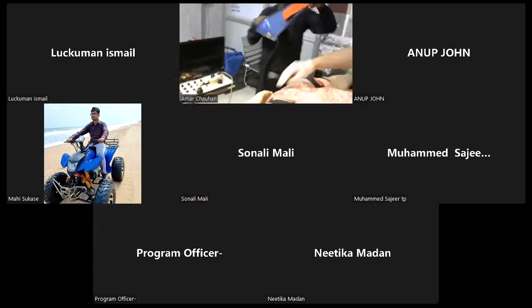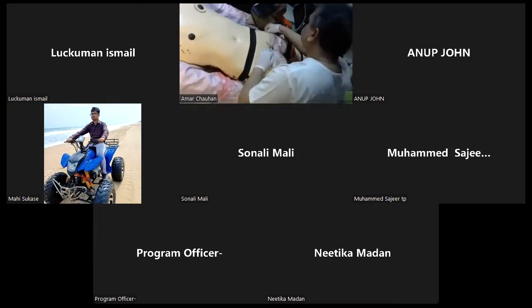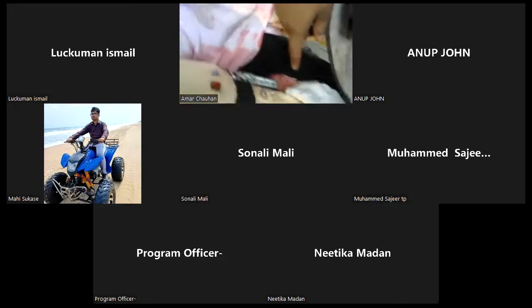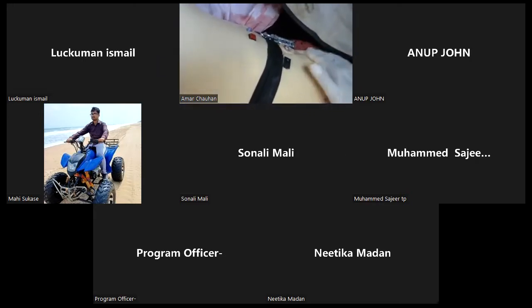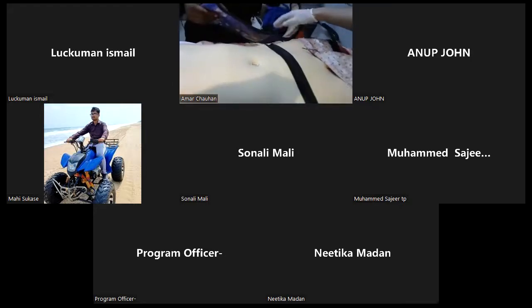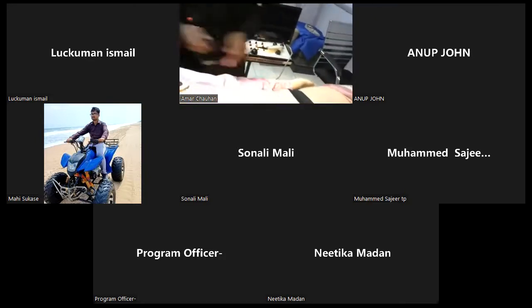So this is our pelvic binder, and the pelvic binder has to be tied on the greater trochanter. So we have given the greater trochanter in this Moulage patient. You will tie the pelvic binder at the level of the greater trochanter. So you can teach candidates how to apply a pelvic binder. And then we have urethral bleed also, hidden injuries.